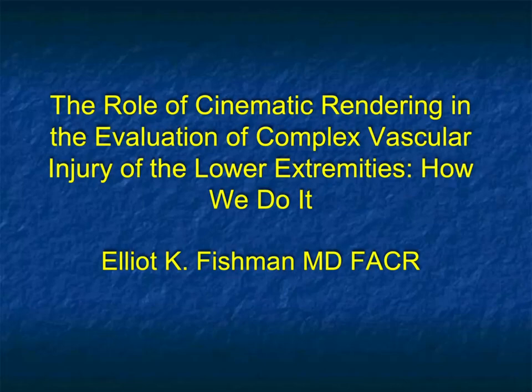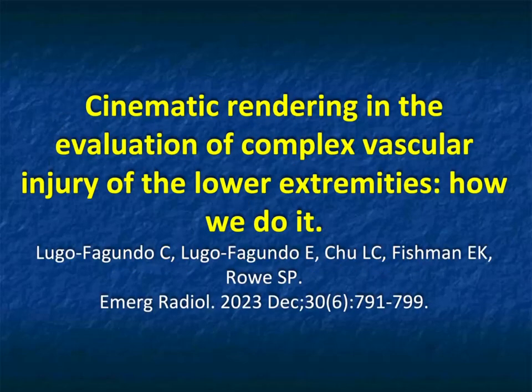This is going to be the role of cinematic rendering in the evaluation of complex vascular injuries of the lower extremity, how we do it. It's an exciting topic, a cutting-edge topic, and a really good article by Carolina Lugo and Elliot Lugo was just published about a month ago in Emergency Radiology. You can find more details in that article.